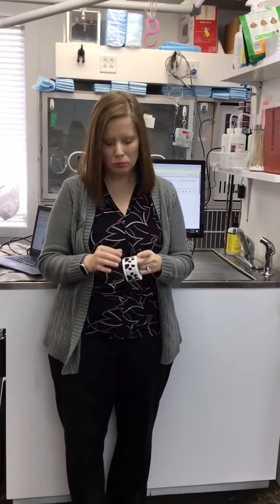I actually went into a clinic and they were not happy with the SediVue, and I said, well, tell me more. It's my favorite thing to say. The doctor just looked at the images and there were just a few crystals. But the original was wall-to-wall crystals. If they had saved those images, he would have seen the before and we could see the outline of them. So always append.